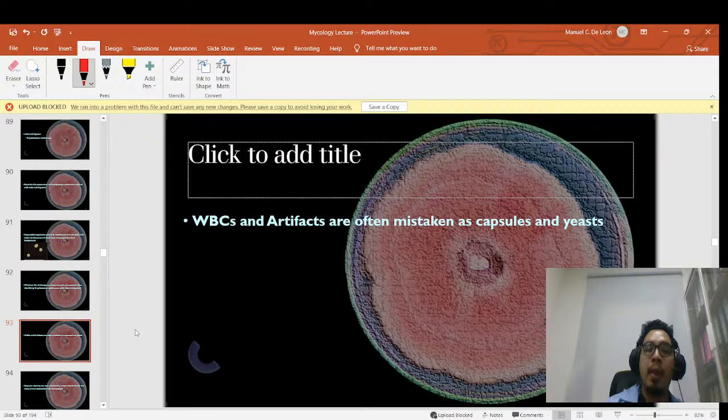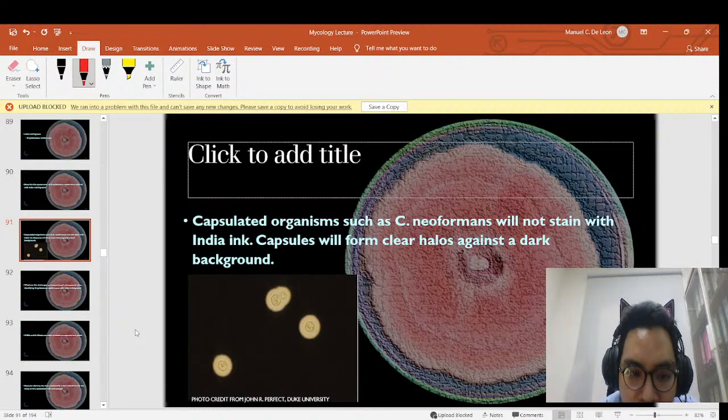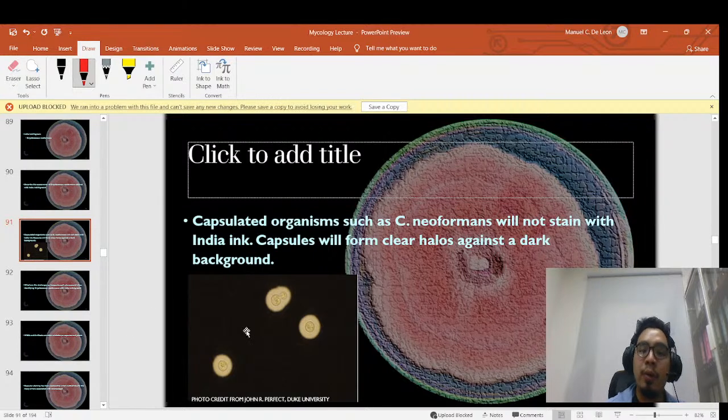One way for you to identify it is by measuring the diameter of the halo and the distance of the halo from the cell. Usually it's around 1 to 2 micra, but it is based on our protocols. It might be different in other hospitals. So please be mindful of this, especially when you're new.